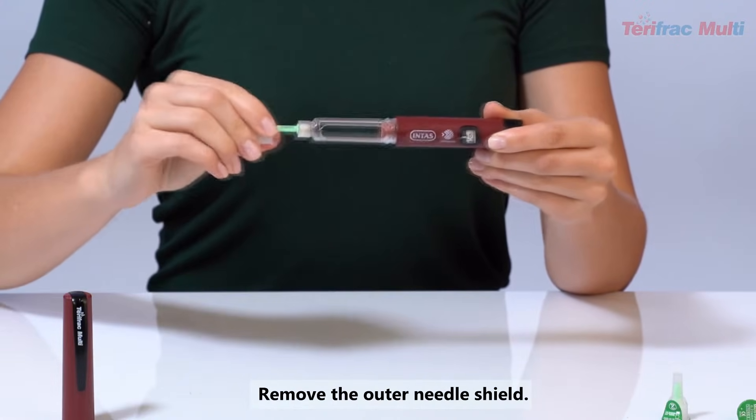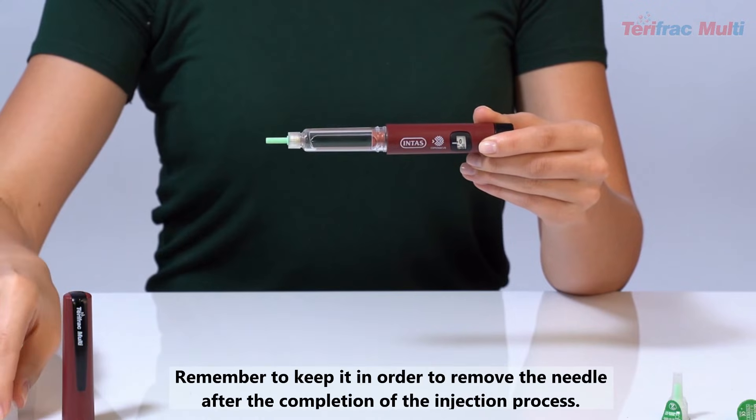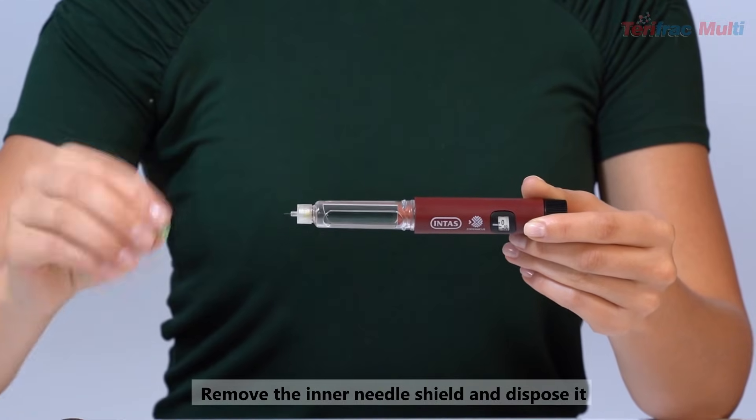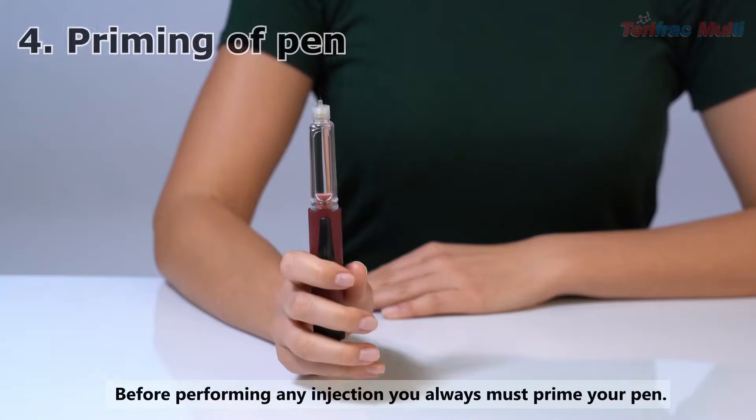Remove the outer needle shield. Remember to keep it in order to remove the needle after the completion of the injection process. Remove the inner needle shield and dispose of it.